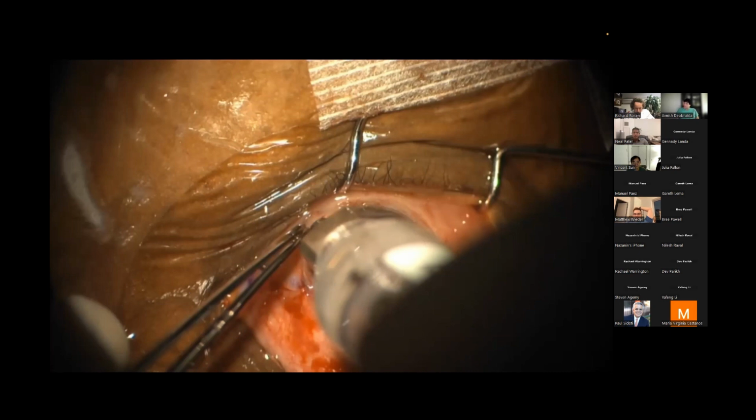You have to do a PI only if there is no chamber. You tried everything, and tomorrow it will be completely blocked, whatever you need to do. But in this case, I wouldn't do a PI unless you're next to the wall, you don't have anything else to do, and you cannot complete the surgery. But it's a very good point that you brought up. So wait, the fear there is that you're going to get pupillary block even though there's a full lens? It's just never occurred to me to do a PI just because air gets into the AC.